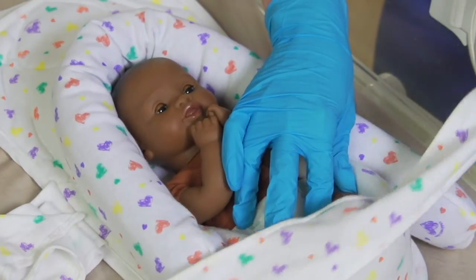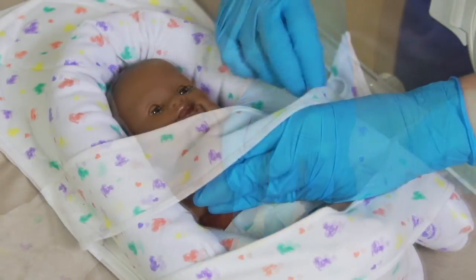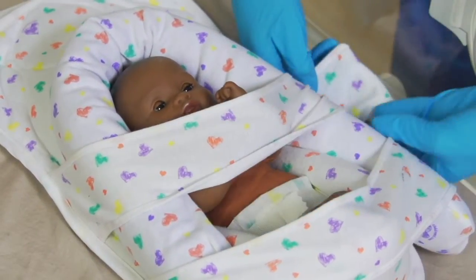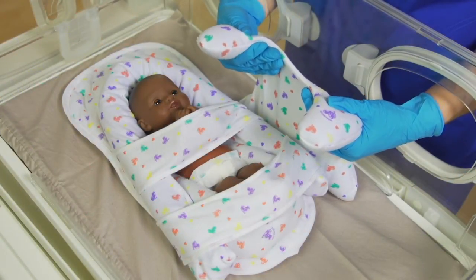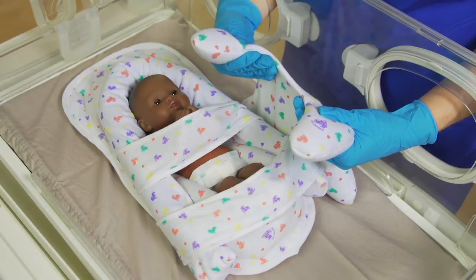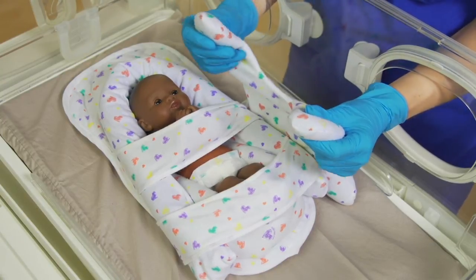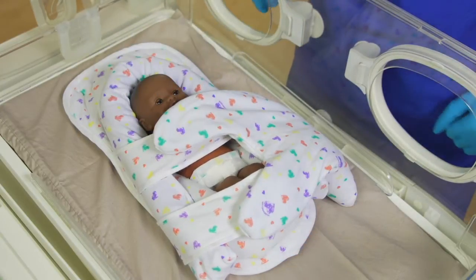Adjust the straps to provide containment, while also allowing for dynamic movement at the hips first, then the shoulders. Frederick T. Frog can augment the bendy bumper for support. Moving the adjustable beads creates the appropriate boundary height. It's important to remember that Frederick T. Frog is designed for weighted support, so do not place its full weight on the infant.